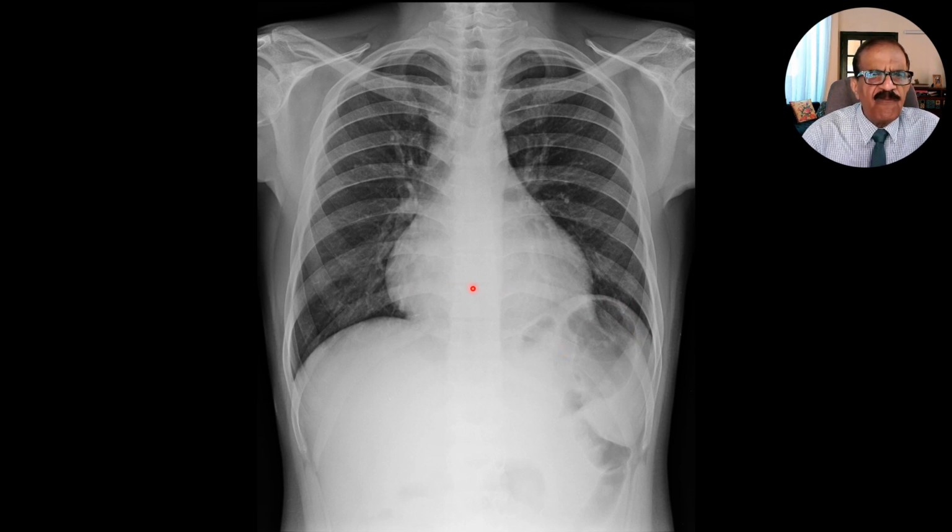So I would consider cardiomegaly, and then based on clinical features, the murmur, I would make a definitive diagnosis. In any case of cardiomegaly seen on X-ray, the definitive confirmatory test would be an echo. Echo will not only confirm if there is cardiomegaly, it will also tell you the cause of the cardiomegaly.